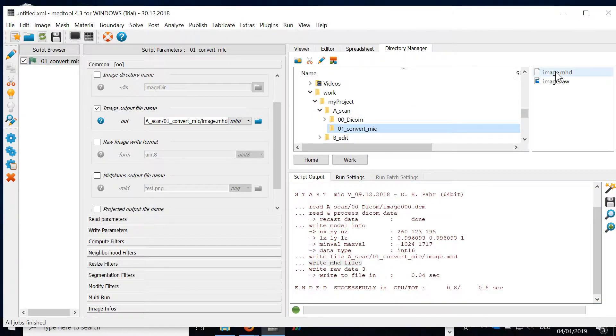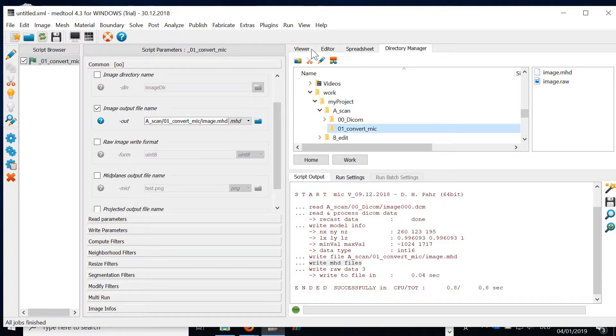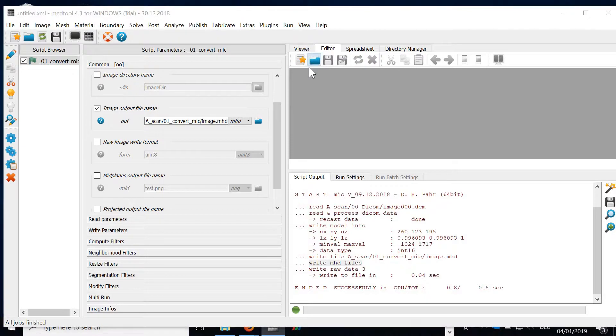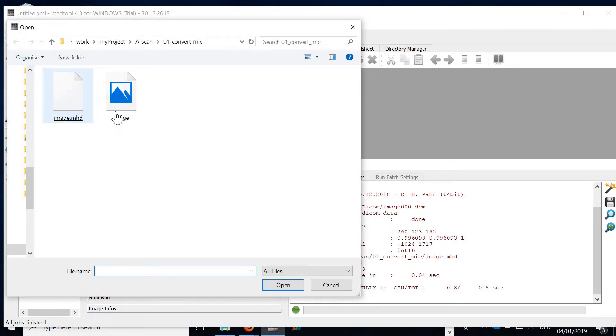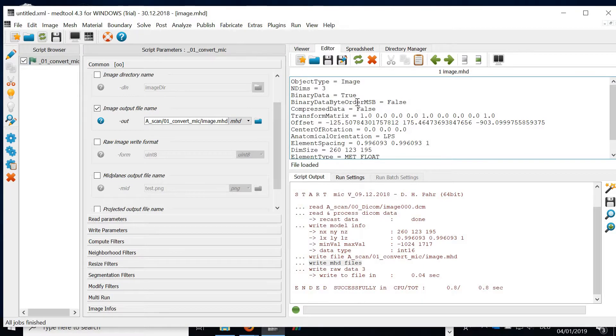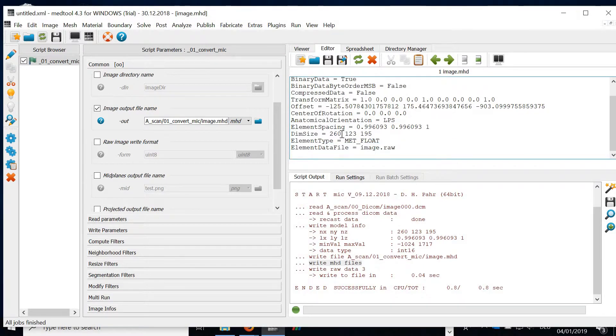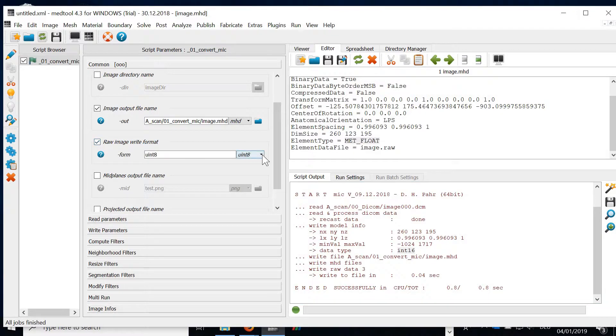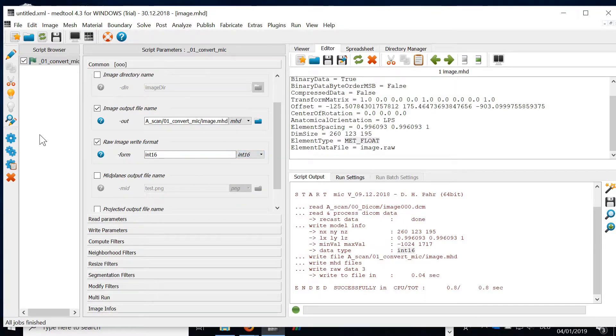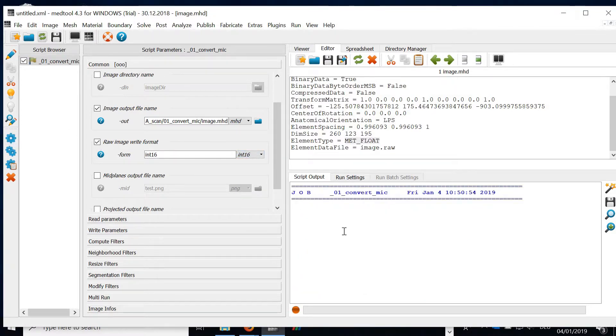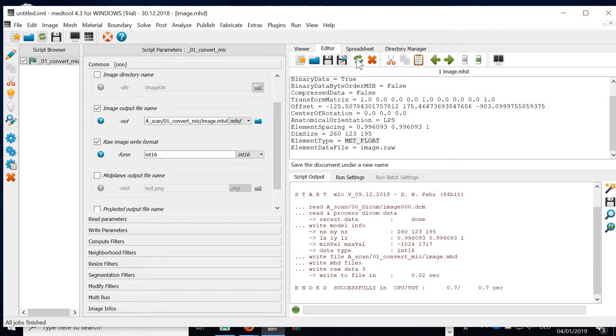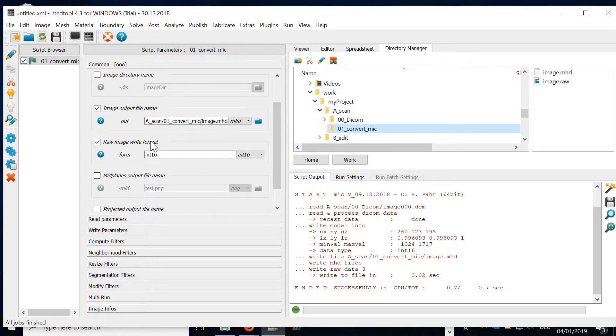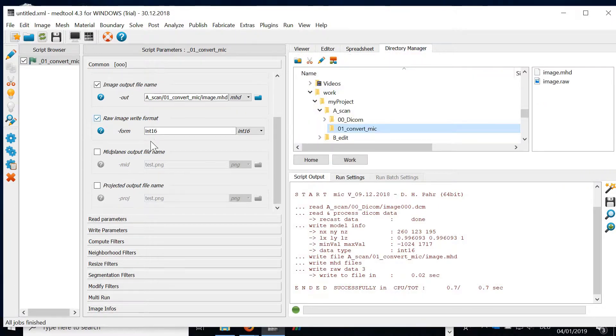Next we have to think about the raw format which we write out. We also see in the folder now two files, the MHD which is a header file and the raw file. We can read the MHD file with the reader. And we see what's inside this file. We detect also that the format is float, but we only would need int16 which only keeps two bytes of memory per data point. Therefore I select here as raw output format int16. I again run it. And reload this file and now we see we have another file format.